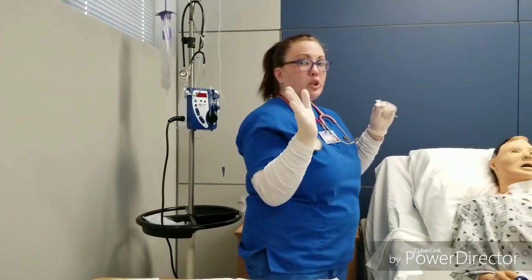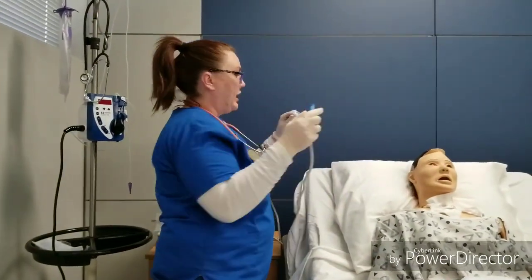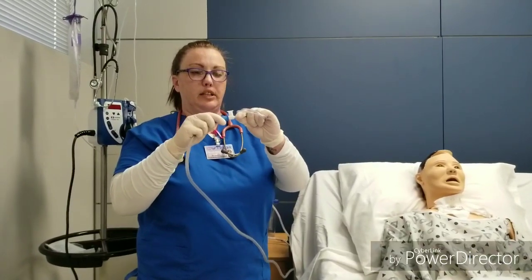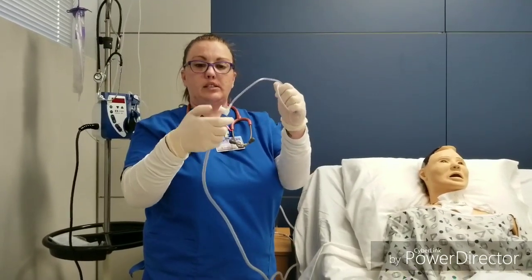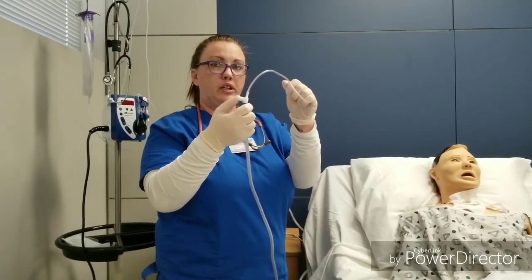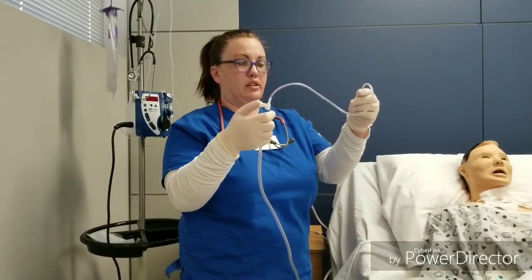Now this hand is no longer going to be sterile. It's clean, but it's not sterile because I've now contaminated it. And you want to attach these two without touching your sterile hand. Now you can hold, and this is how you apply suction. You hold your finger on, it applies continuous suction. You let it off and on, it's intermittent.